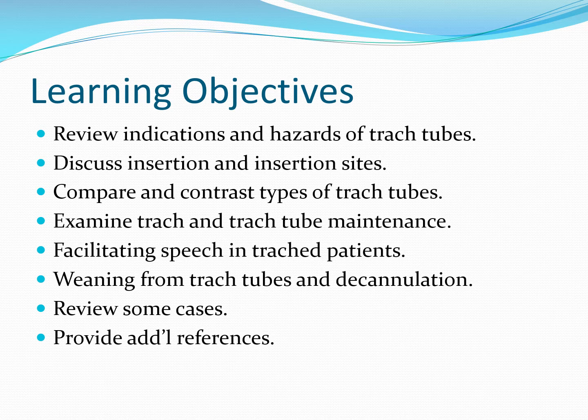If it does, that the patient gets the appropriate treatment to treat that infection, if you will. And the actual maintenance of the tube itself and the retaining device, the drain sponges that capture any leakage or mucus, etc. Very, very important to keep that site clean and well maintained.